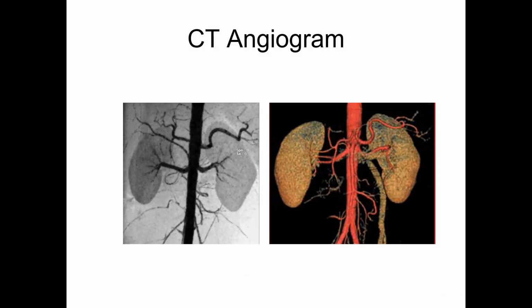So this information of the renal artery is useful because in hypertensive patients, sometimes you could have renal artery stenosis either at the ostium or in the distal part. If it's fibromuscular dysplasia, it will be the distal part. If it is atherosclerotic ostial calcifications or stenosis at the ostium, usually in the middle and old age, you'll find the narrowing at this part, at the origin of the renal artery. So renal artery stenosis, you can easily pick up on CT angiogram. The same information you can also have through ultrasound Doppler, but it requires a little more expertise, okay?